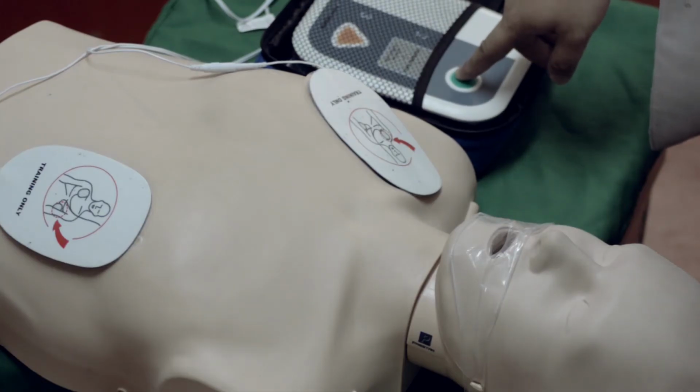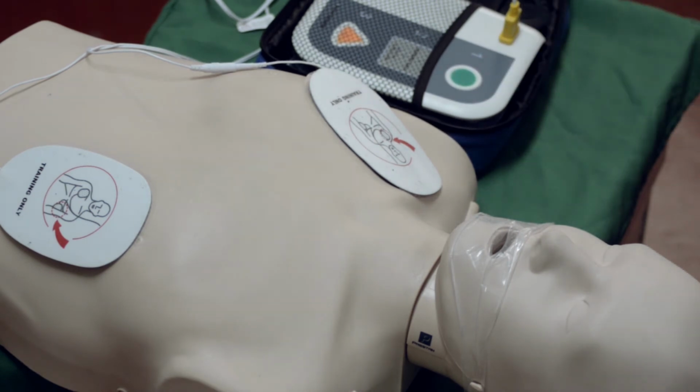Analyzing heart rhythm. The AED instructs us to apply pads to the patient's bare chest and then plug in the connector to the AED machine. When doing so, the AED automatically analyzes the heart rhythm. It will analyze whether or not it needs to deliver an electronic shock to the patient's chest, or heart rather. Analyzing heart rhythm. Do not touch the patient. Shock advised.